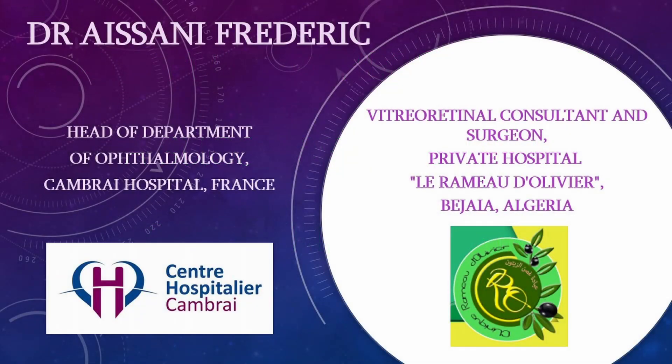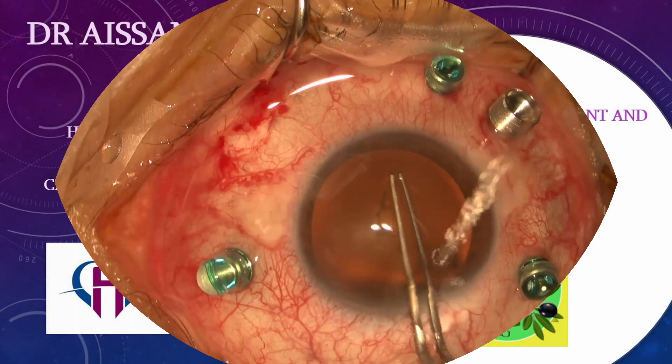Hi everyone. Toro vitrectomy, complete closure of all retinal breaks, and the releasing of all vitro-retinal tractions are the guidelines for a successful retinal detachment surgery.